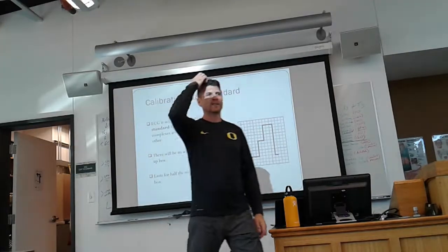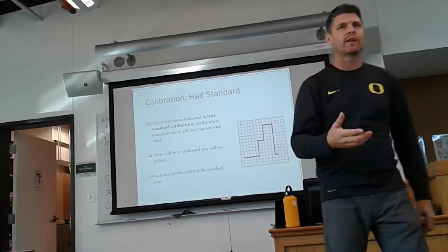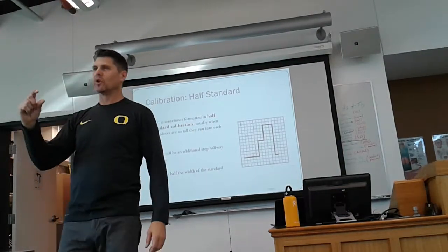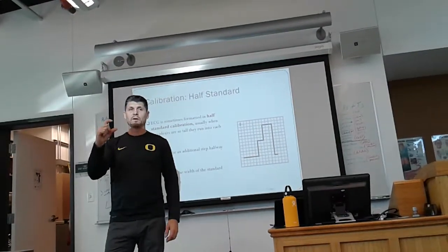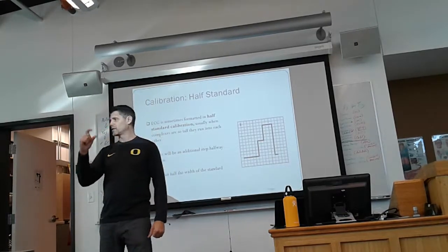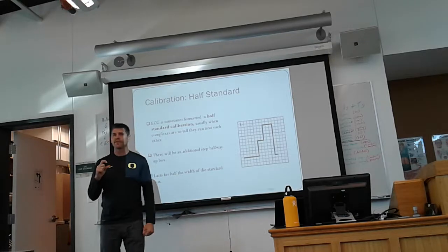So anything that I talk to you about how to measure for hypertrophy or anything like that would have to go out the window because the amplitude wouldn't be the same. Proportionally, it would be the same, but you'd have to do that calculation on your own. You'd have to do that adjustment, and you'd have to know that that's the case.